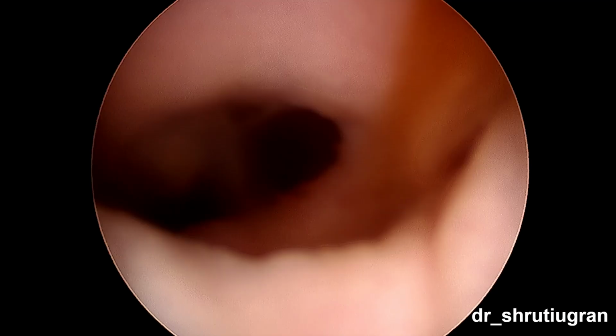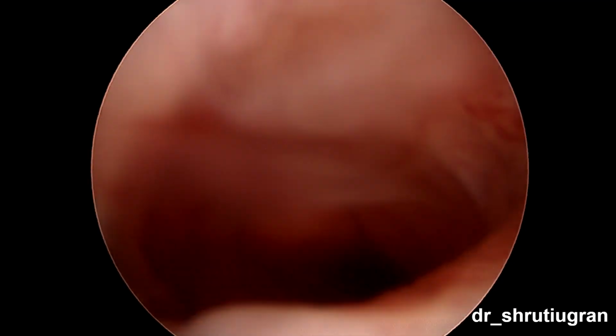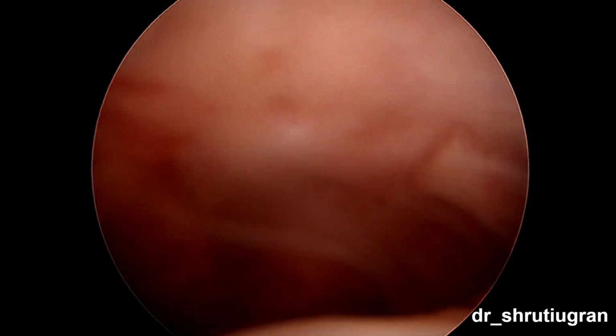Presenting a case of hysteroscopy. This was a 34-year-old lady with previous 2 IVF failures. We posted her for a hysteroscopy pre-ET to look for any pathologies. The ultrasound was absolutely normal.